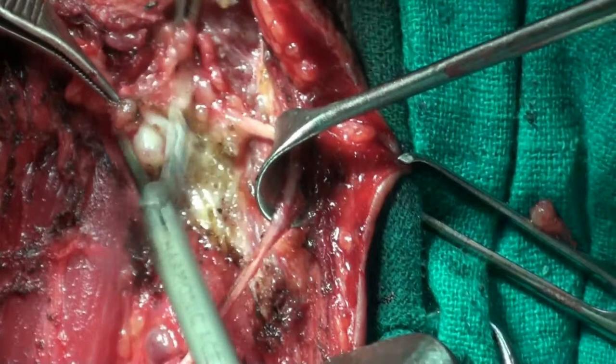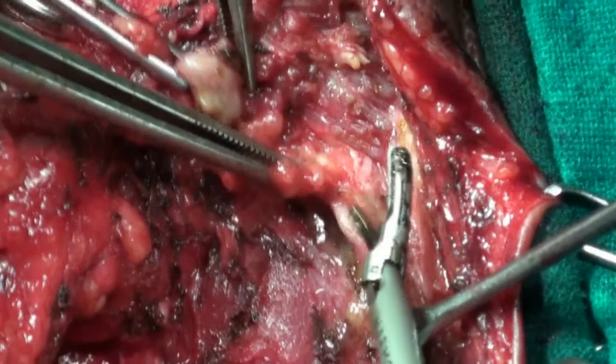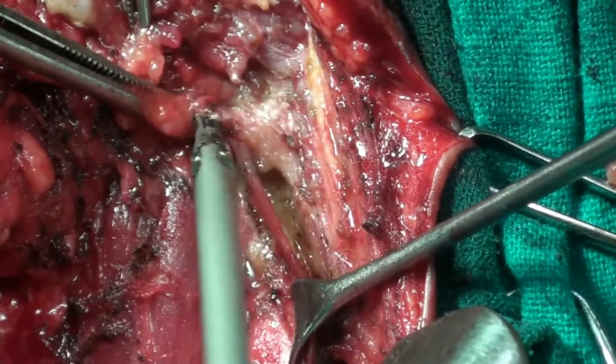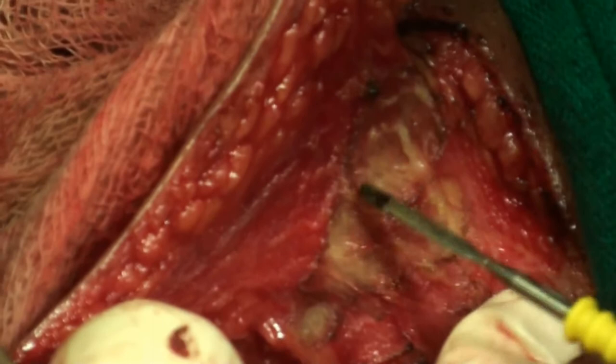So we weren't joking after all. 2B has nodes. Cut the muscle. Now that's a branch to the sternomastoid, which I'm cutting now. Subplatysma. There is no platysma posteriorly, but now there is platysma here. We have to take care of it.